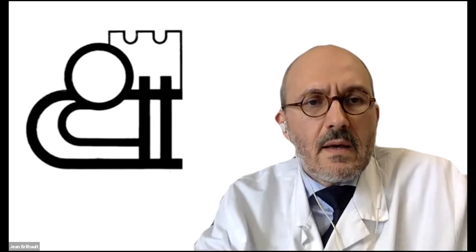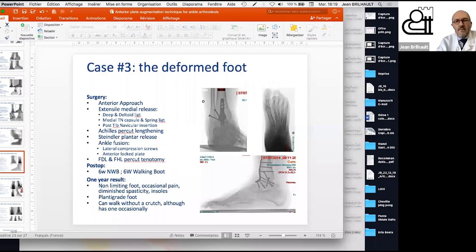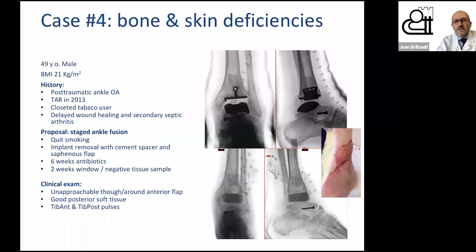I will share my screen with you because I have an example of that kind of case. So this is an arthroplasty on a closeted tobacco user, which I had to deal with. He ended up with some cement, antibiotics, and a flap. And in that specific case, I could not approach the ankle up front. So I went on the back.